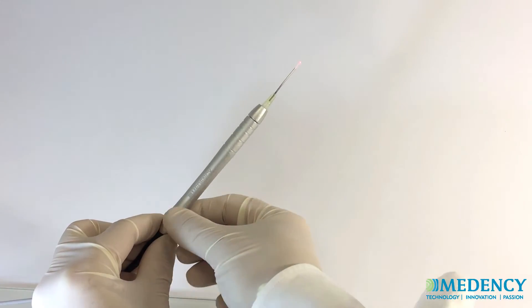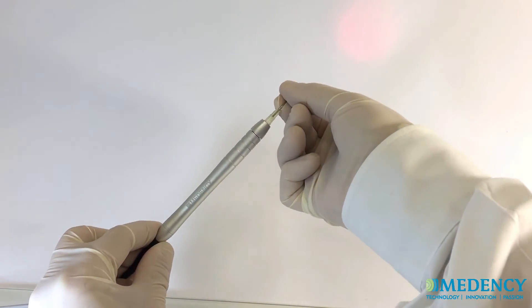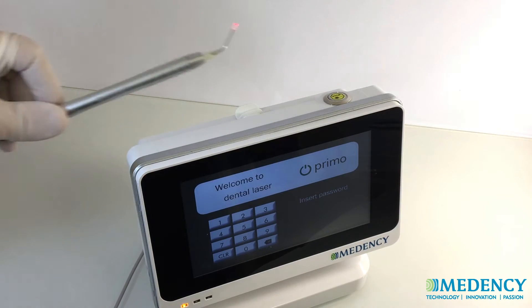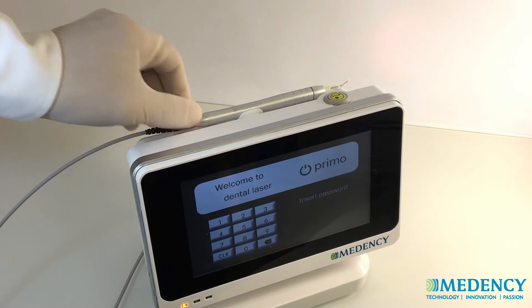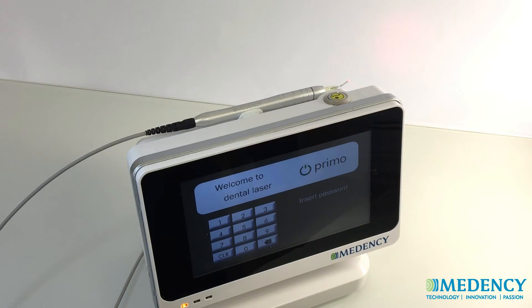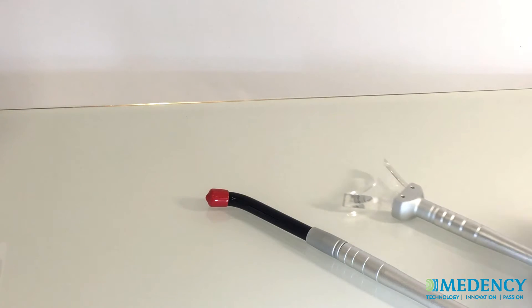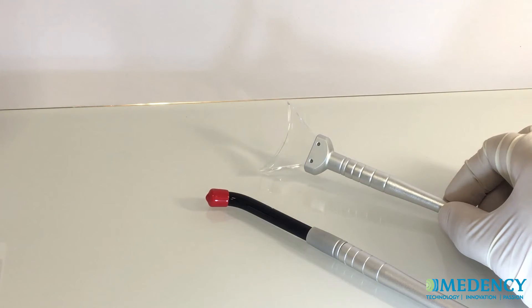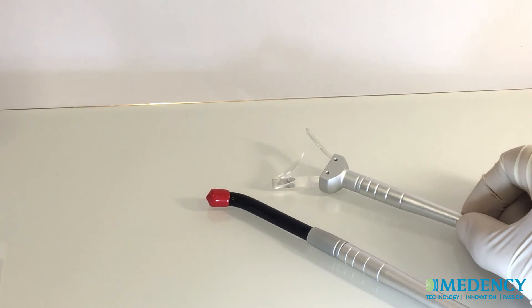Once the tip is installed, it's possible to bend it as desired. Be careful not to make too sharp of an angle. The handpiece is now ready to use. To store the handpiece, place it in the handpiece holder located at the top of the laser console. For whitening and therapy handpiece installation, please refer to the user manual for installation instructions.